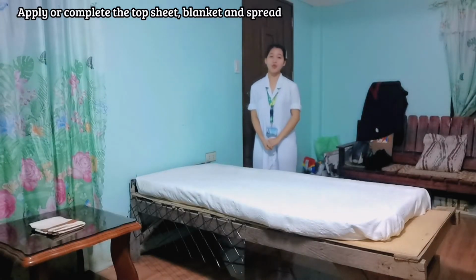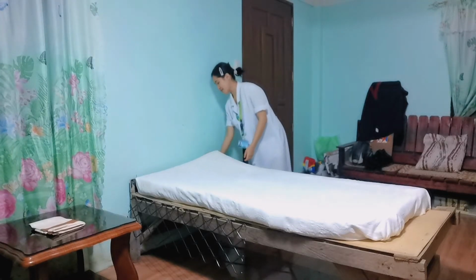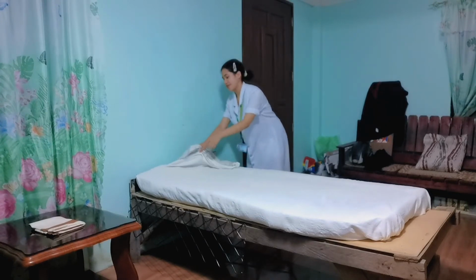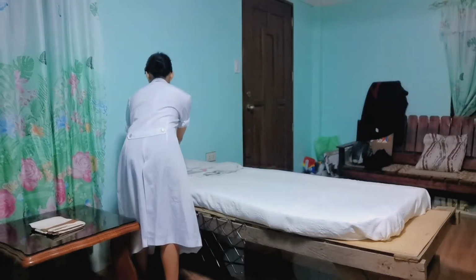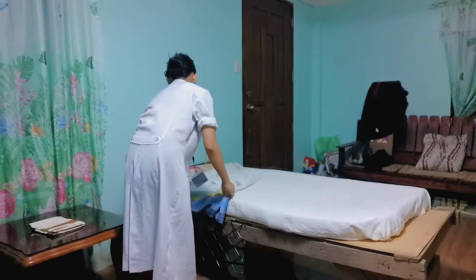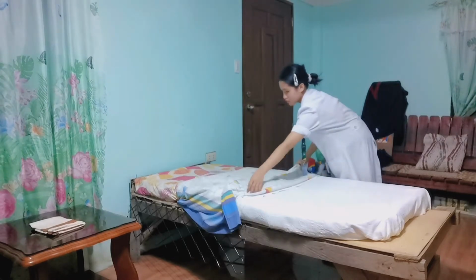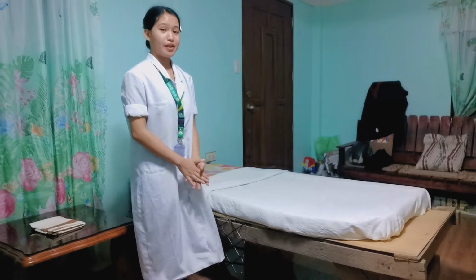The next one is we're going to fold the top sheet together with the blanket towards the bottom sheet of the mattress to create an opening. This will now become an open bed.